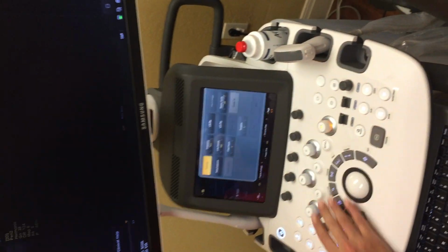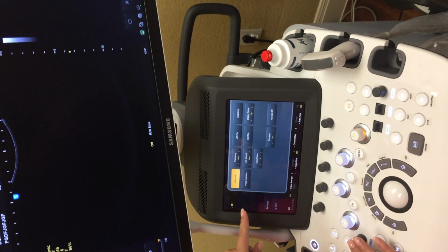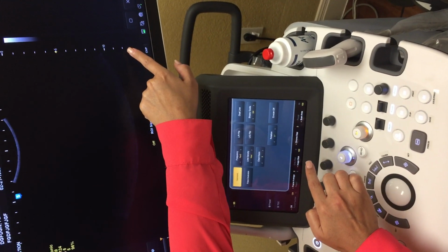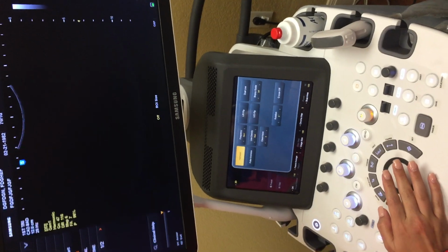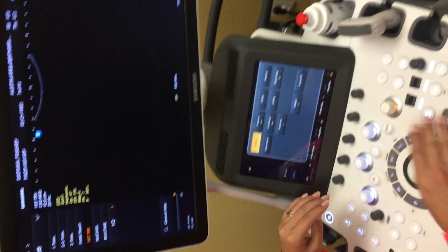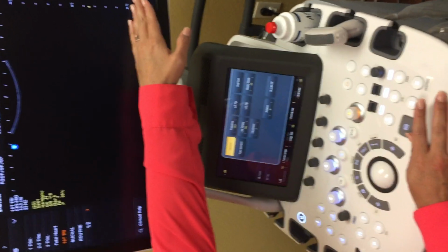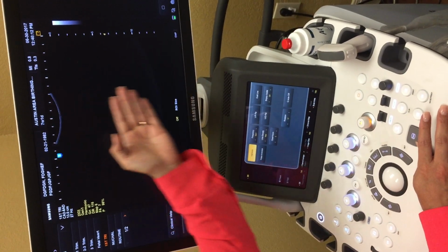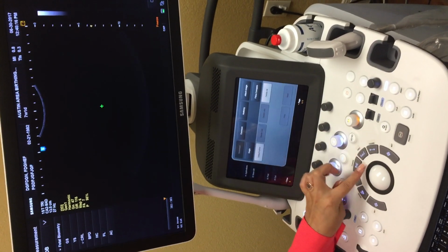So if I'm at first trimester, look at the depth, how the depth changes. Did it not change? And I just counted myself. Okay, never mind, don't listen to me then. It didn't do it. First trimester would be at a lower depth, whereas a second trimester would be at a higher depth. It accounts for that depth. That's the only difference. Let me just show you calc though.